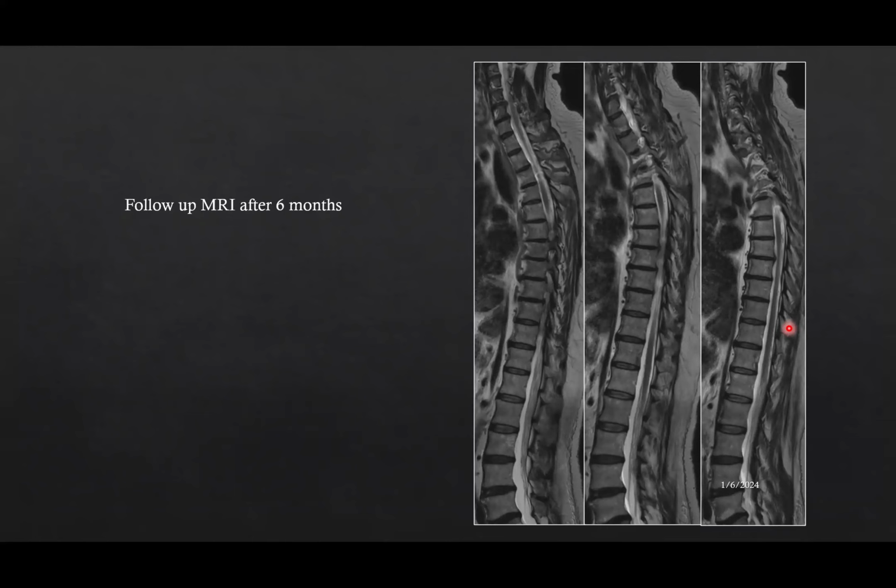Now the idea of showing this case was that this is an epidural arteriovenous fistula, unlike a dural arteriovenous fistula where the fistula's point is at the neural foramen or in the nerve root sleeve, and they generally have only single feeders. Very rarely you see multiple feeders in them.